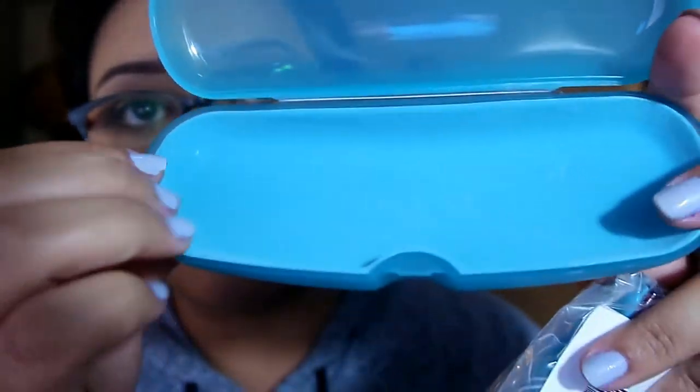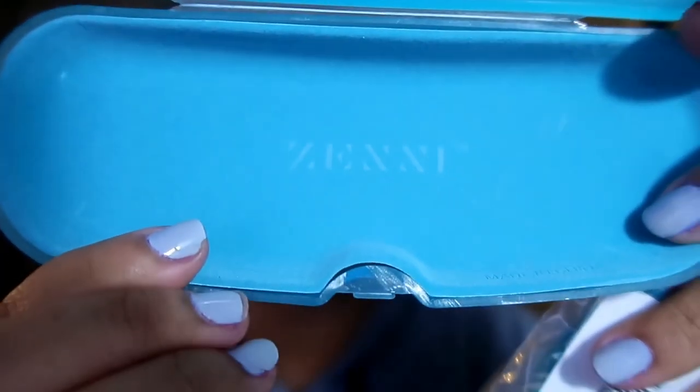It is recyclable, which is great. The shipping process was pretty good — it said 10 to 14 days and I swear I ordered it like a week ago, so they did pretty good. It comes in a teal hard plastic case, very pretty. Inside it has a felt material lining and it says Zenni on there as well. It's a very nice teal case.